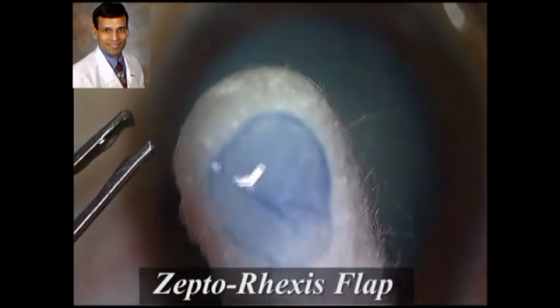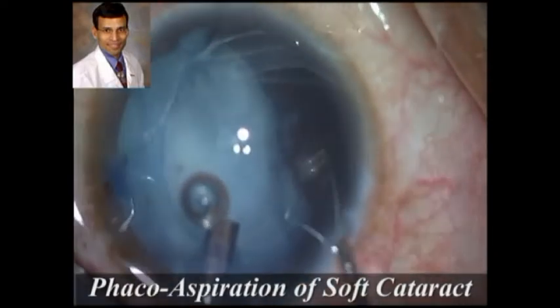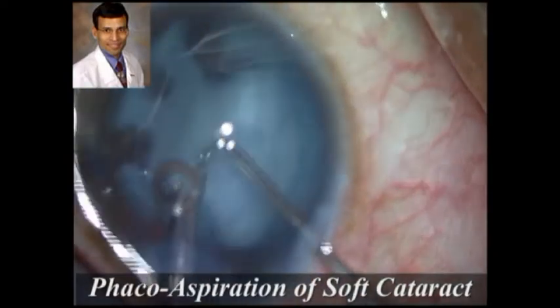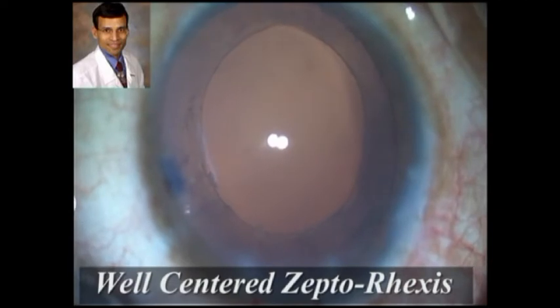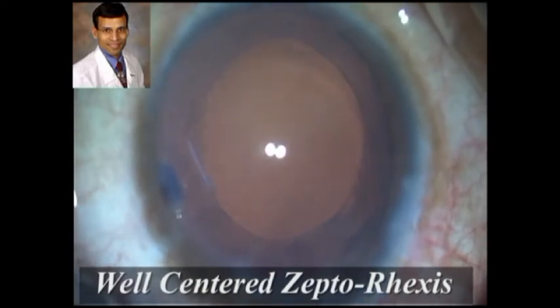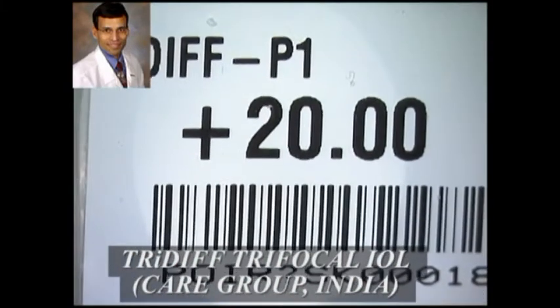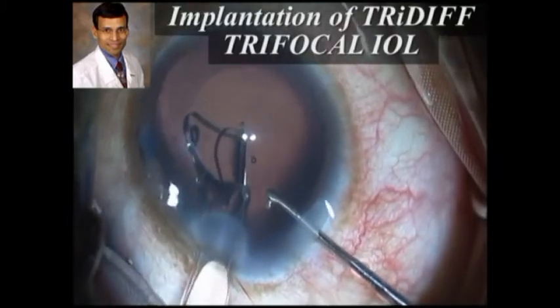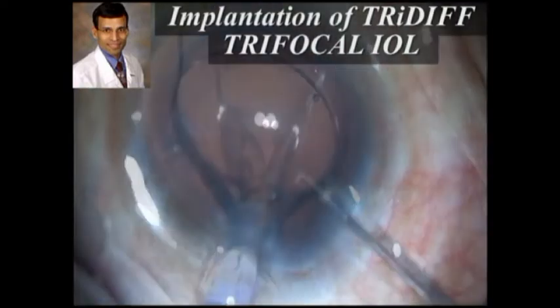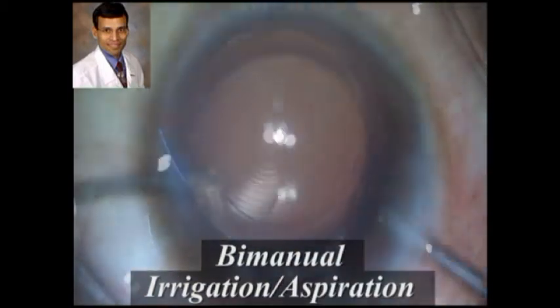This is the capsulorrhexis that has been created — the margins, as you can see, are extremely smooth with no ragged edges. Because this is only a 36-year-old patient the cataract is fairly soft and can be easily removed through phaco emulsification. We can now see the beauty of the capsulotomy: very well centered and very smooth, which is of crucial importance for the performance of premium IOLs. This is the Tri-Diff trifocal IOL marketed by the Care Group India being implanted into the capsular bag, providing good distance, near, as well as intermediate vision. As you can see, this is a very well centered IOL.